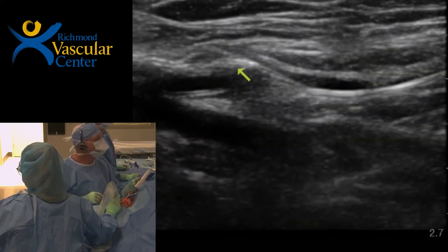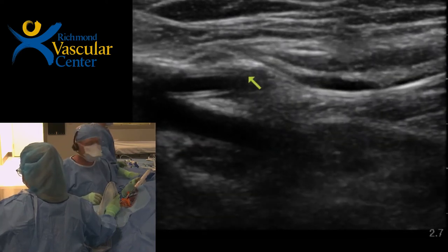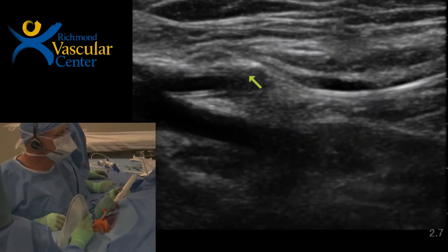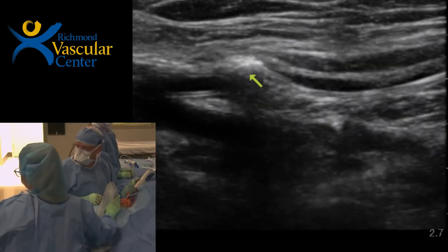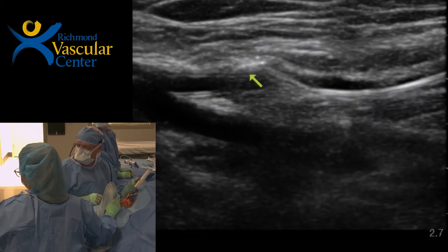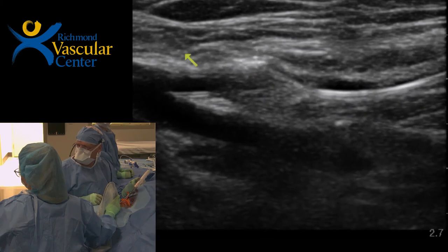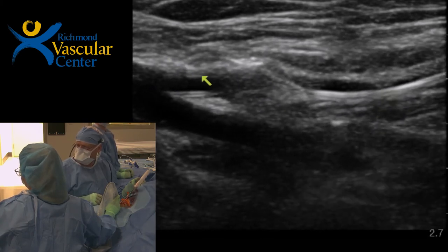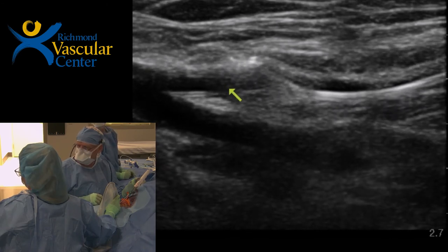All right, so what kind of gap do you have? 0.1. So she's going to now hit the activation button. Activate. All right. So these are short activation pulses, and we're going to let this run until it stops on its own. You see microbubbles going down the artery and up the vein. And I like to see that. That also is a good indication that you're in the right place.